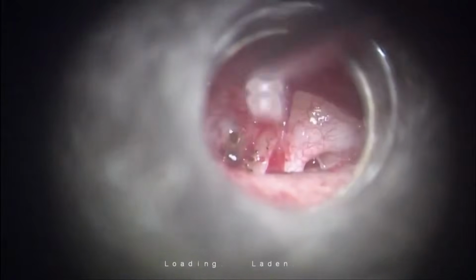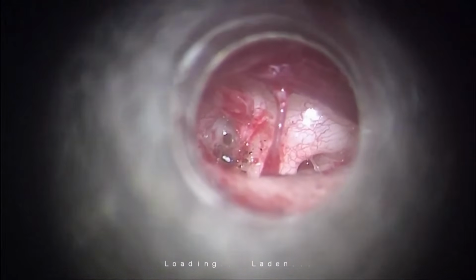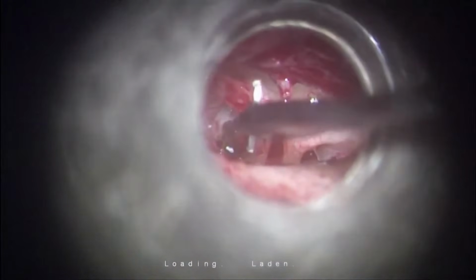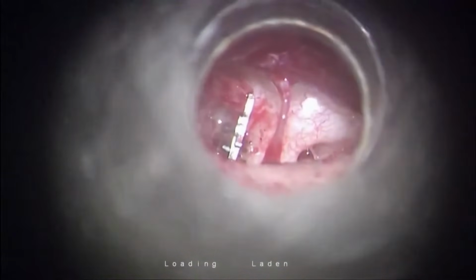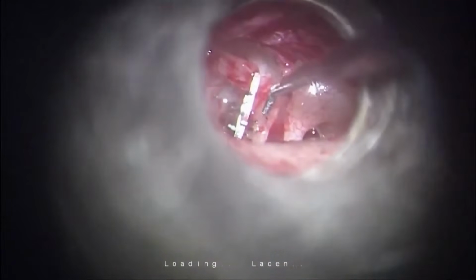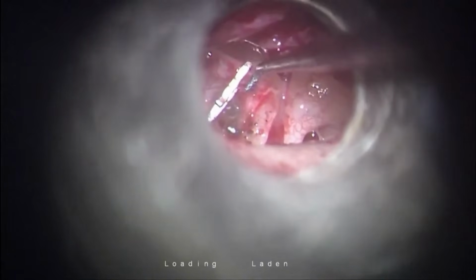Just a minute. What I will do is place my piston at the fenestra. See the piston at the fenestra? Yes, sir. And this is the piston which is going to take the long process of the incus. See this?